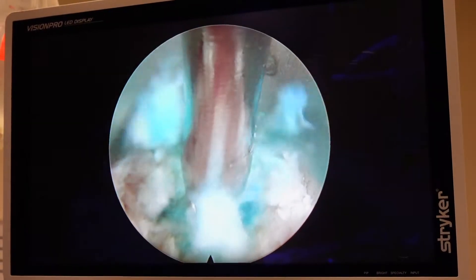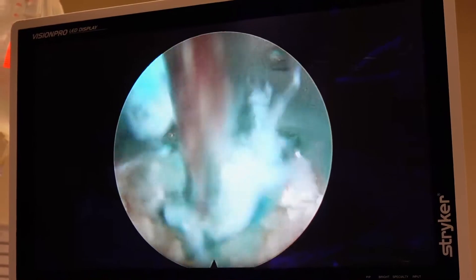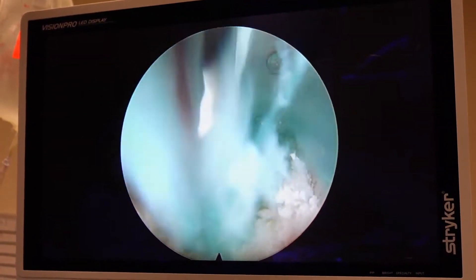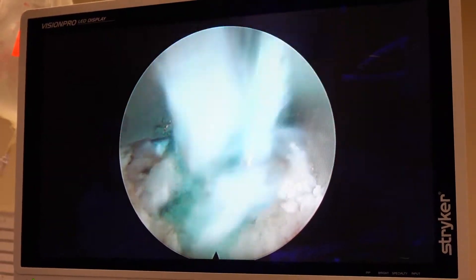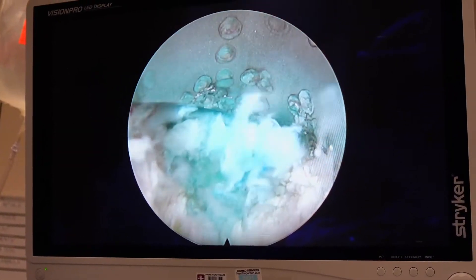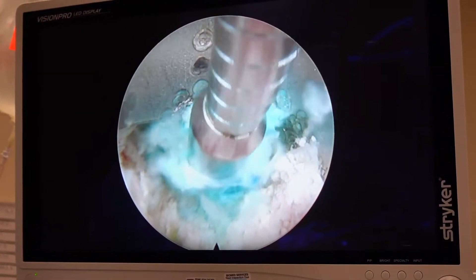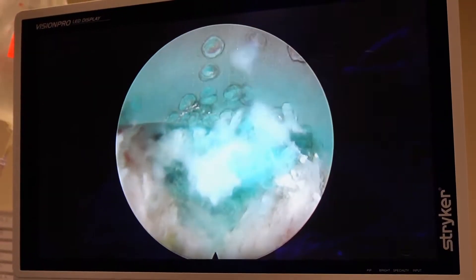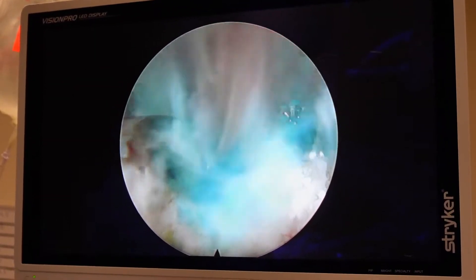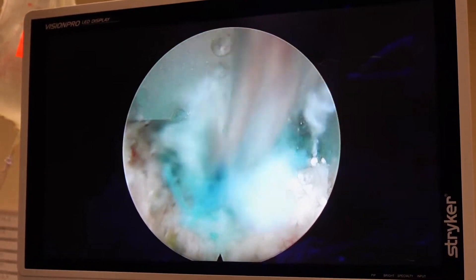I'm looking for something called the Mikey Fragment — it'll come out like a little poop. Don't tell Mikey I said that. This is a curved grasper, reaching under and up. You can just tell something wants to squirt out.